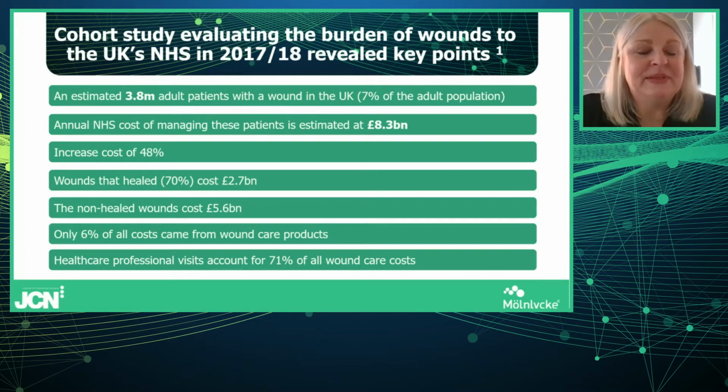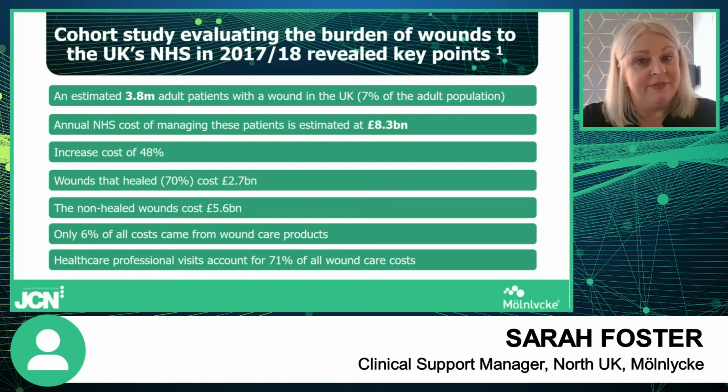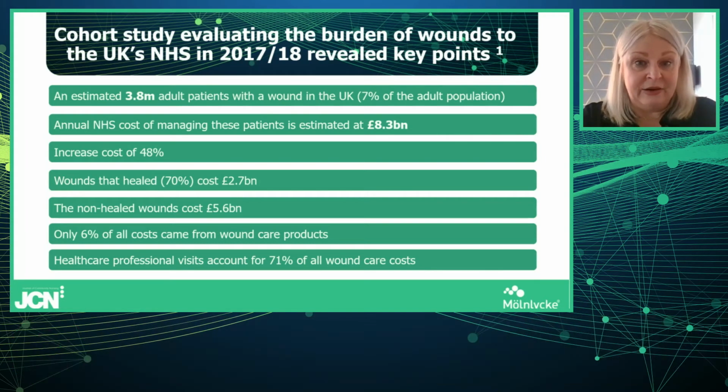Thanks, Maeve. So one of the questions in the survey that we asked you to complete before the session was, what type of wounds do you currently use a gelling fibre on? So you said that the highest percentage was on lower limb ulcers, and then pressure ulcers, and also malignant wounds. And I feel that these answers really do reflect the increases in prevalence, which are detailed in the new Julian Guest paper. The figures there showed a 101% increase in venous leg ulcers over a 5-year period, with 85% of those patients being managed on district nurse caseloads.